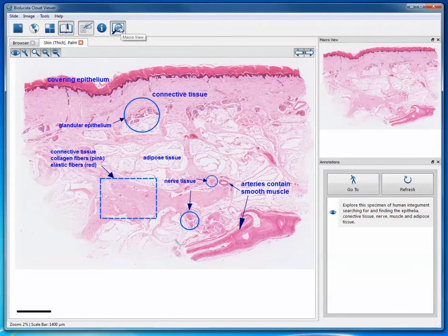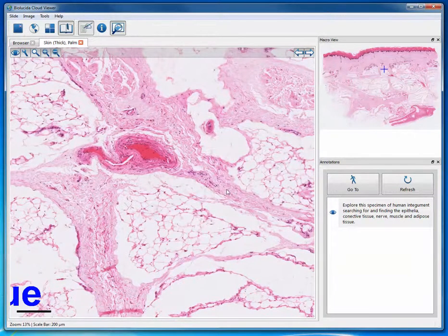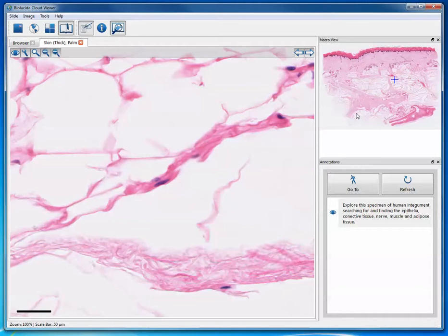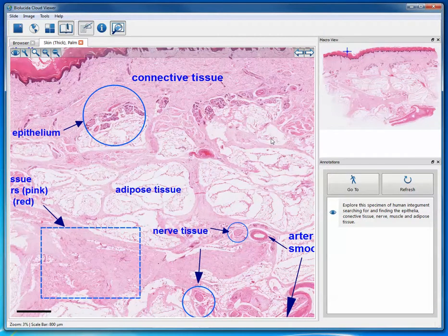It is best always to view the specimen with the magnifying glass clicked on. That's the reference specimen. So you see, if I go up at higher magnification, this tells you exactly where I'm located and magnifying this specimen. Okay, so those are just a few tips.